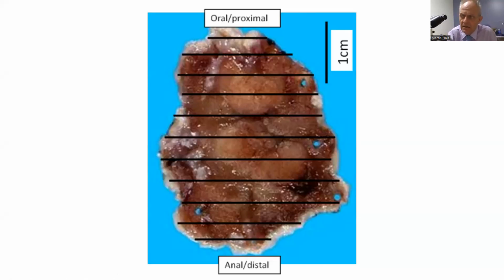10 sections, each of which will get a 4 micron slice. So effectively, all we're looking at is 40 microns of tissue over a 4 centimeter piece of tissue. So what we're sampling, in fact, is very small. Now, you may say, well, that's a bit of a disaster. Well, the answer is not really, because if we see an area that requires further investigation, we can then go and delineate that particular area.